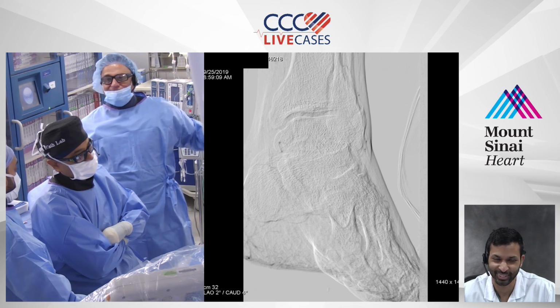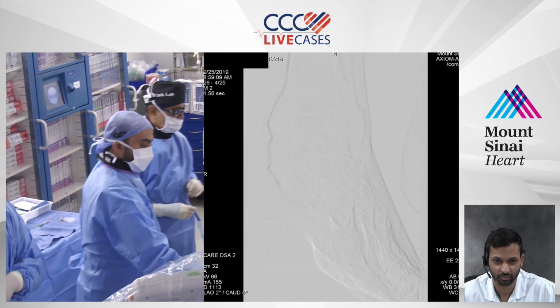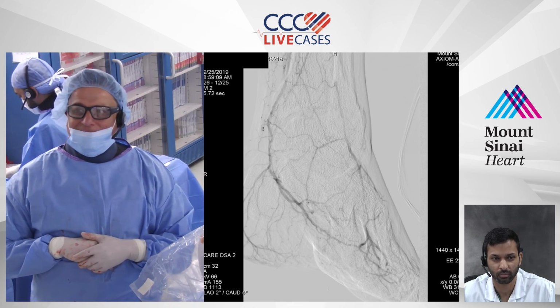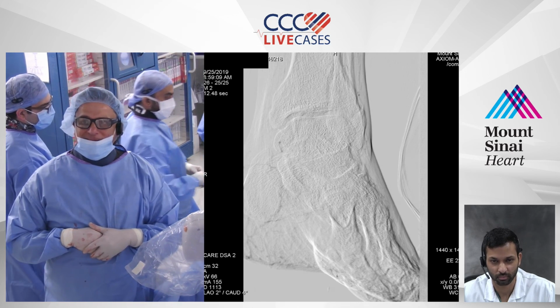I'm not going to chase this. I don't want to put a stent in if I don't have to. And I'm not even going to touch that proximal stent, because I told you the PSVR ratios weren't significant. I think if I do more, I may embolize from that at this stage. We'll check if he has a palpable pulse, we'll do ankle pressures, and then we'll see how he does.